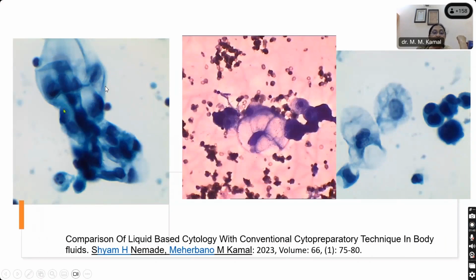Now again, you have some more cells coming, and in mucin secreting adenocarcinomas, you get such gigantic cells with huge vacuoles indenting the nucleus. And here, in contrast, you can see these mucin secreting malignant cells. And what are these cells?